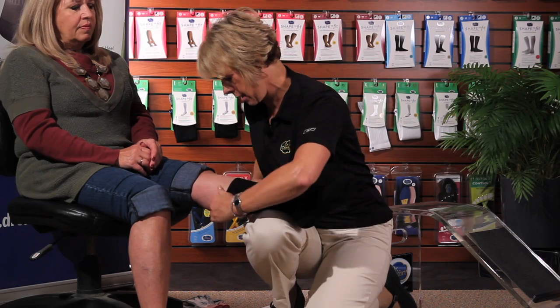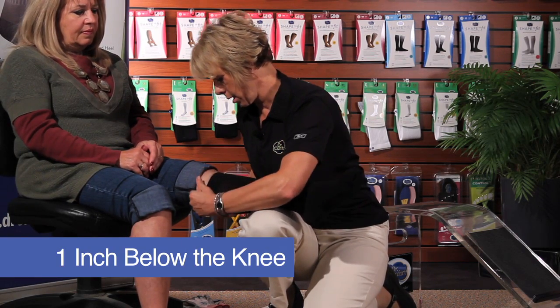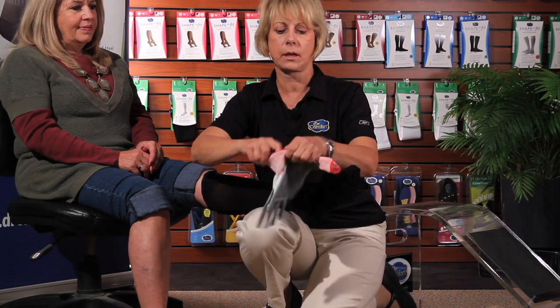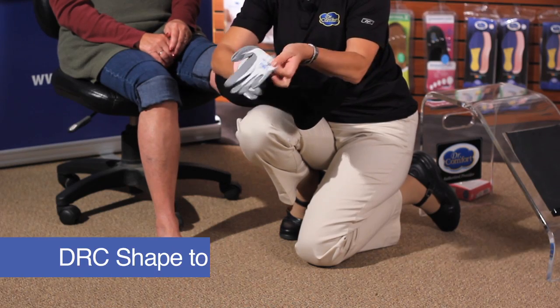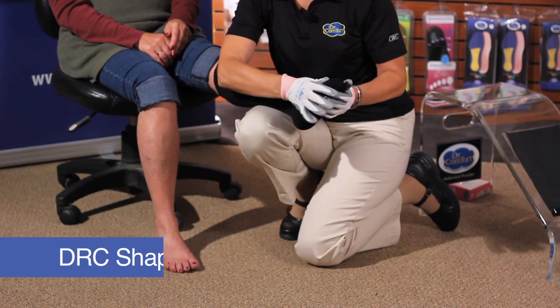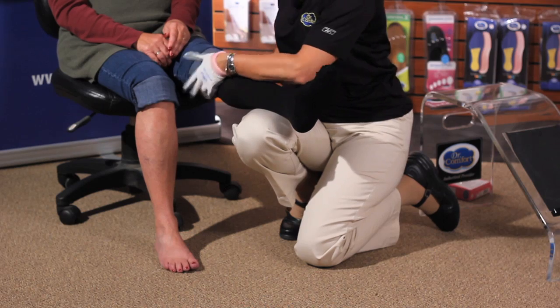Then you work the stocking up to about one inch below the knee. Sometimes it works to use donning gloves, and Dr. Comfort Shape-to-Fit offers those. These have a tacky surface, and you can continue to straighten out the hose with the gloves.